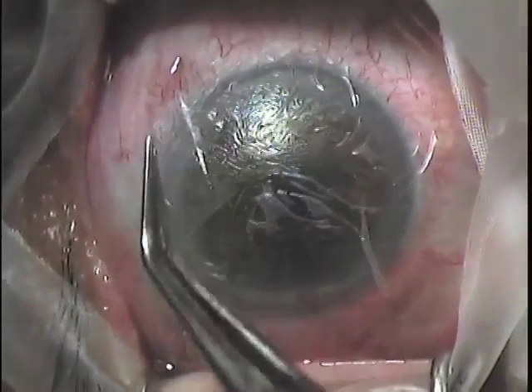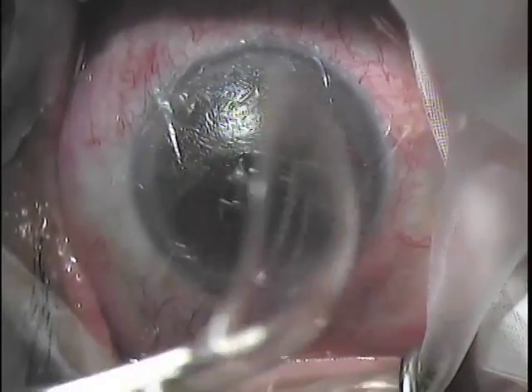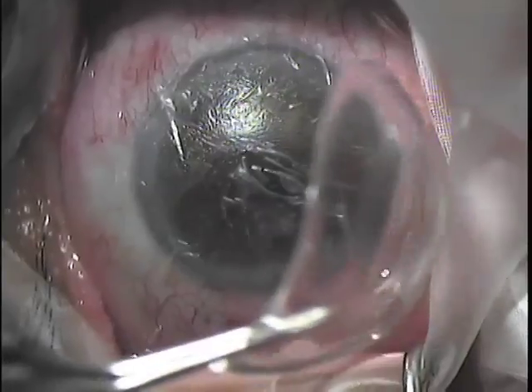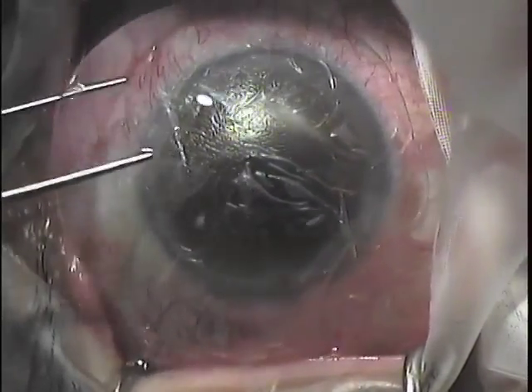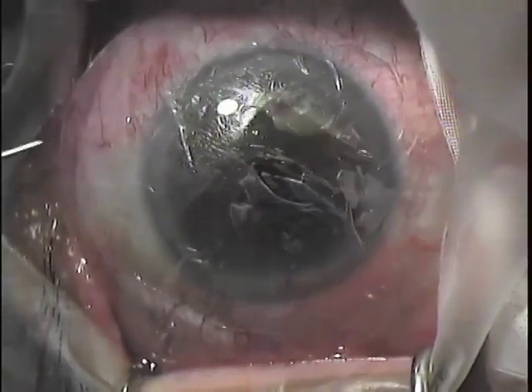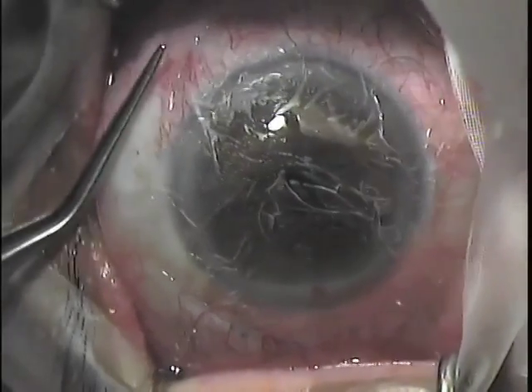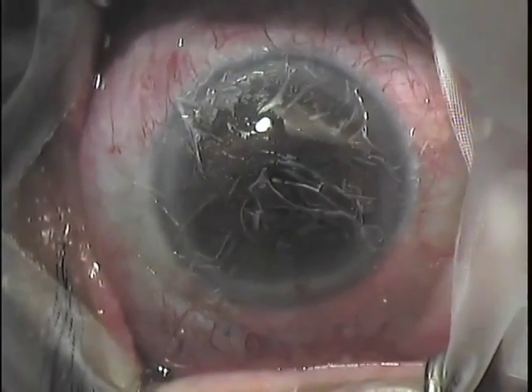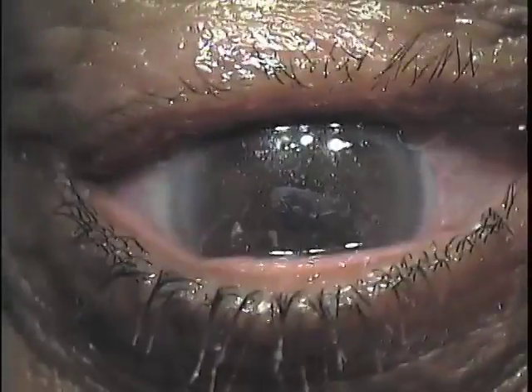The last step is to take a contour contact lens using non-toothed forceps and place it down onto the amnion without sliding it around, so there's minimal tractional forces that would potentially dislodge the amnion. The stria and air bubbles that you'll see under the amniotic membrane will fairly quickly disappear.